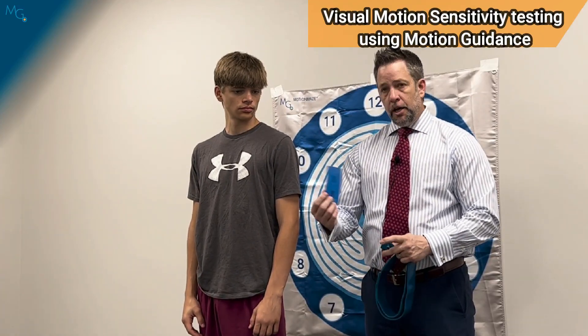Performing the visual motion sensitivity test utilizing motion guidance. We're going to need the second to largest strap, the perpendicular mount, the green rechargeable laser, and our 3x5 card.